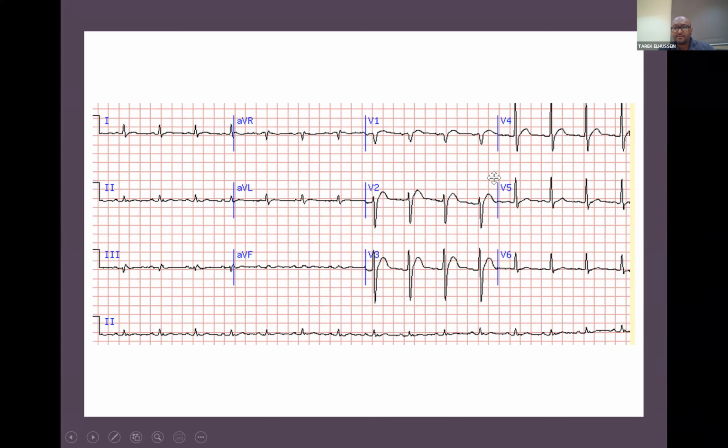Okay, so there is always a rule in the ECG, guys: any ECG that tires you, you look at it, it looks normal to your eyes, you're looking there, there is nothing abnormal. Always look for electrolyte disturbance, because this is the trickiest thing. And the ECG most of the time is near normal, meaning they won't give you a completely normal ECG in the exam. Okay, although if they did, we always say this: the most difficult ECG in an ECG exam is a normal ECG.